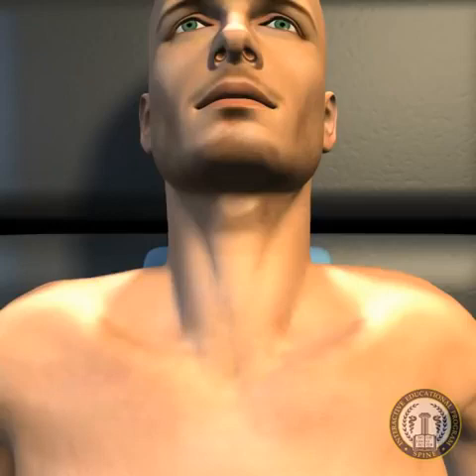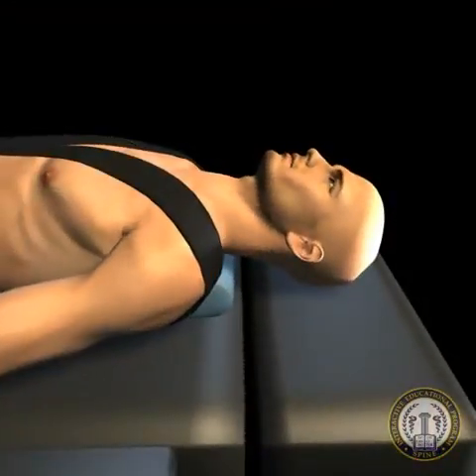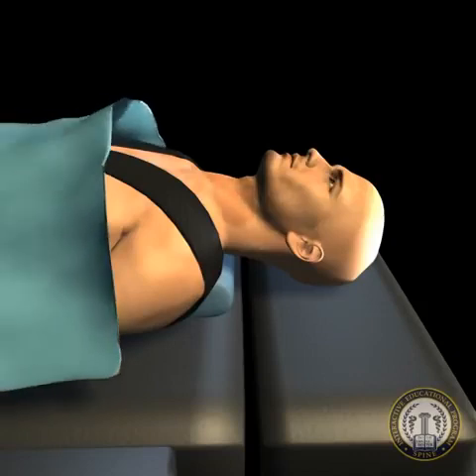If there is a concern that intraoperative radiographic visualization of the cervical spine may be blocked, the shoulders should be pulled down and held in place, for example with tape. The patient is now prepped and draped in sterile fashion.